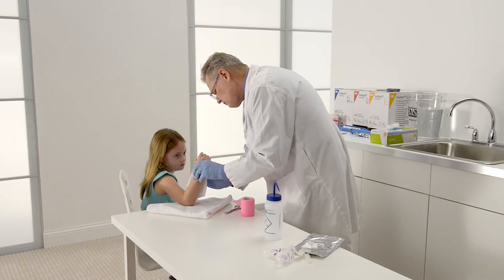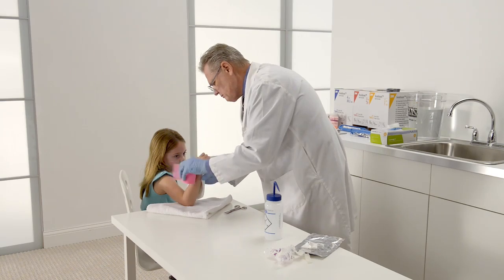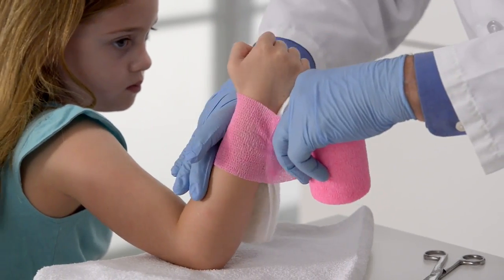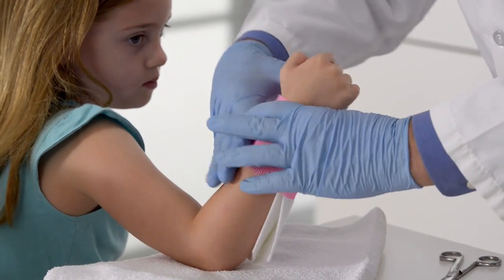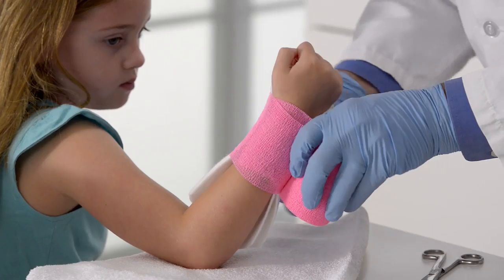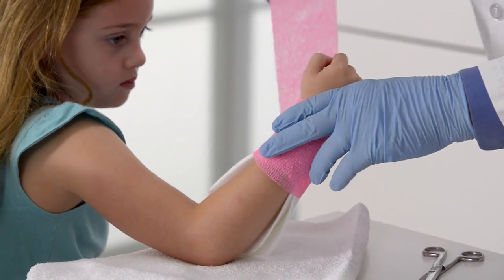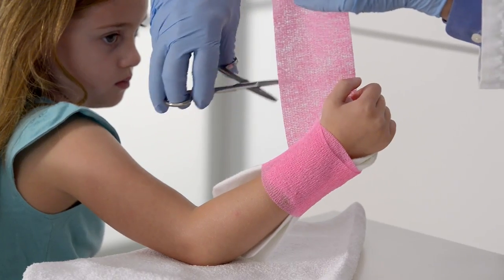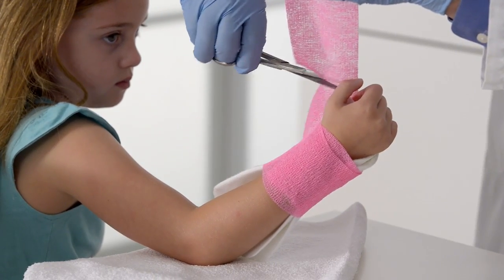Once your splint is wet and excess water has been removed, apply the splint starting at the distal palmar crease, allowing it to follow the natural contours of the forearm. Now start overwrapping the splint using 3M Coban self-adherent wrap. Alternatives could be bias-cut stockinette or an ACE elastic bandage.